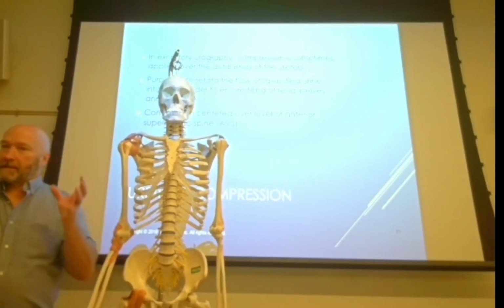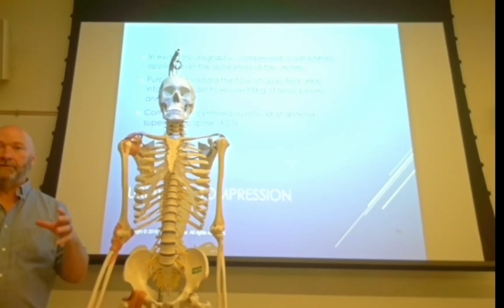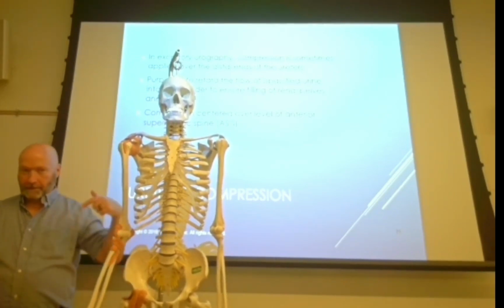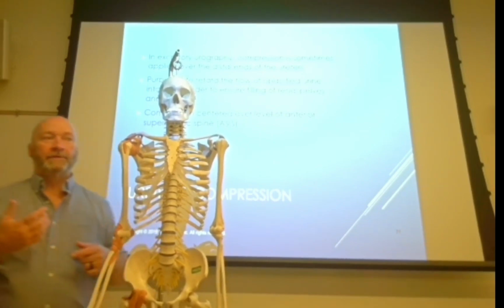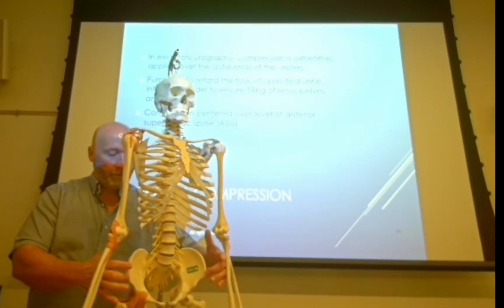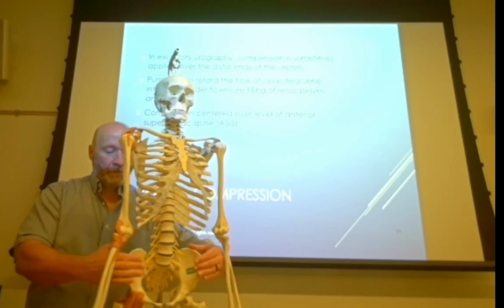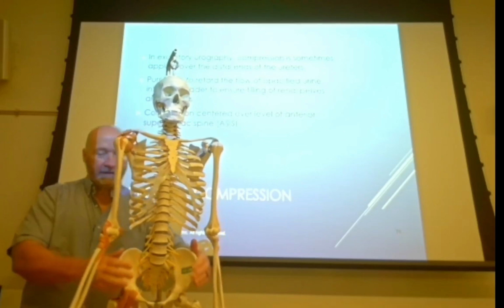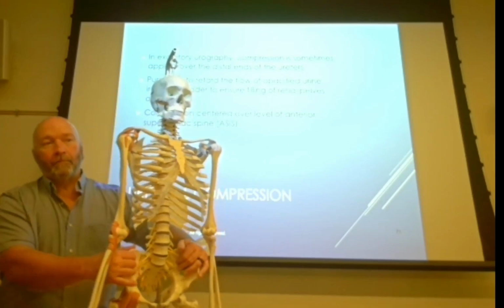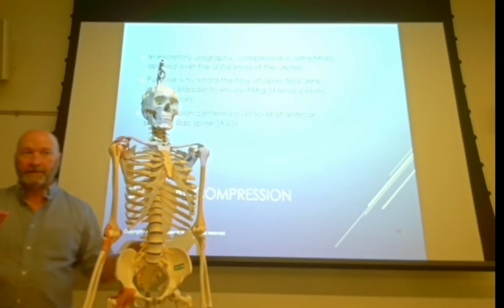And what we should see is that parenchymal blush of the kidneys. So it's starting to pick up the contrast, it's starting to pull it out, right? And sometimes it'll already start to come down the ureter. So what we want to do is to slow it down a little bit, and what we can do is put compression devices. Where we'll put those is just medial to the ASIS. Okay, so ASIS is right there. So what we're trying to do is put these compression devices so that it will push back into the soft tissue of the abdomen and compress all that and kind of squeeze off the ureters a little bit to try to keep some of that contrast up in the kidneys.